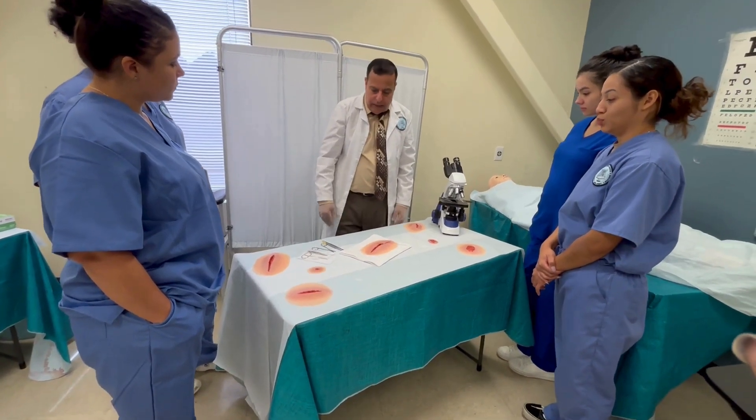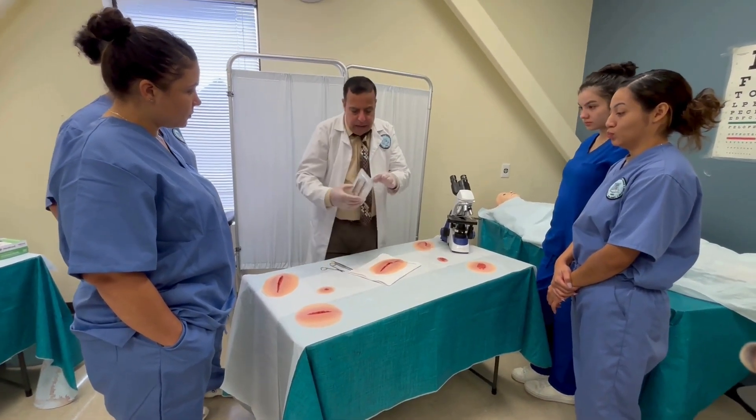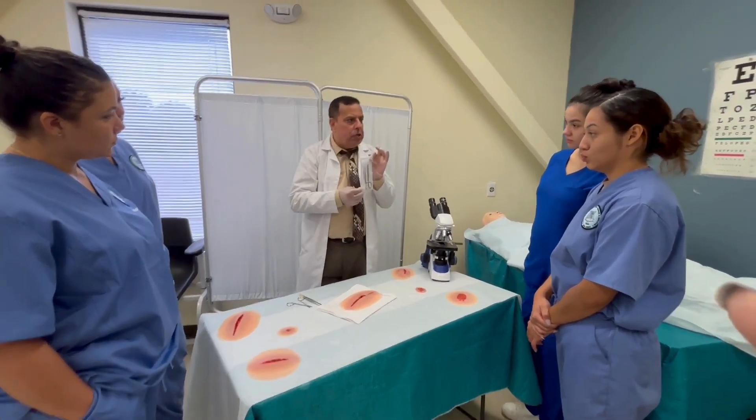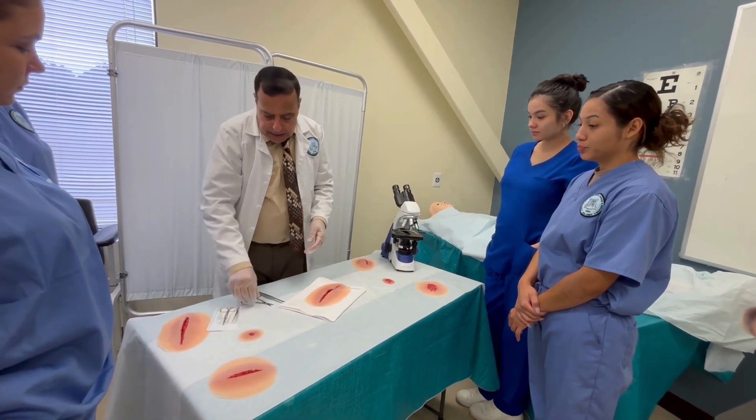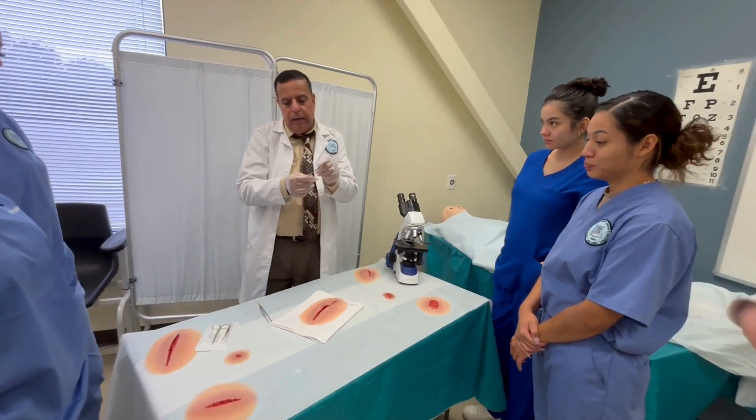What I need for this procedure is a suture removal kit. It contains forceps and scissors. If you look at the scissors, they have a small circle tip that goes underneath the suture.